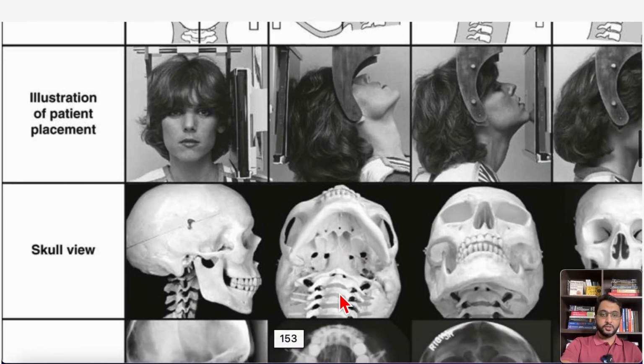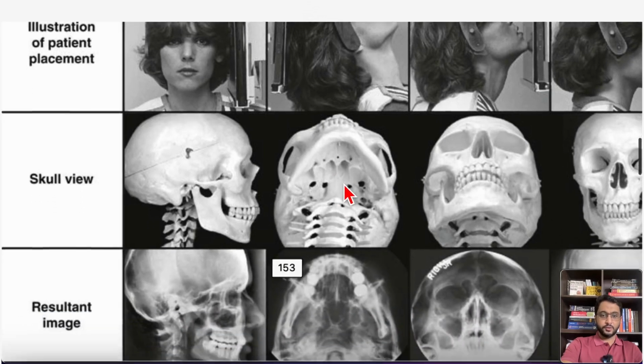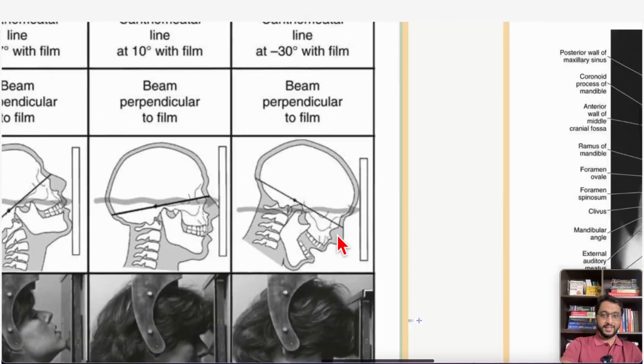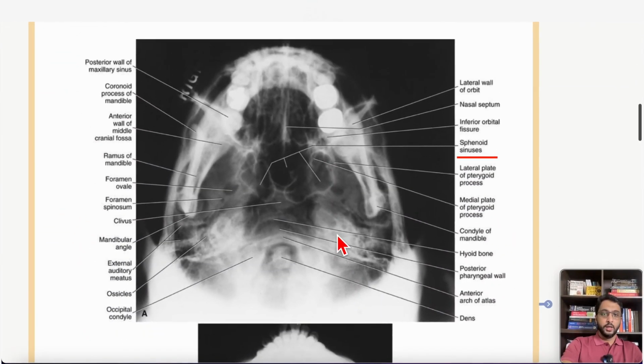See how you can see, this is a picture, this is a visualization. Now very clearly one bone is standing out. What is that? The zygomatic arch, very clear. You can even see the base of the skull. This is your actual skull view. You know that in X-ray you can even see the base of your skull, so that is a major area where we are looking. But it's not over yet, I'll show you more. Even if an image-based question comes here, it should not confuse you that this is your particular SMV view.